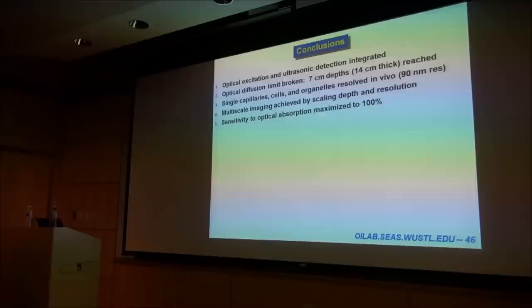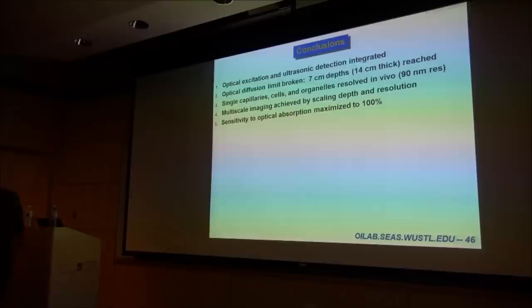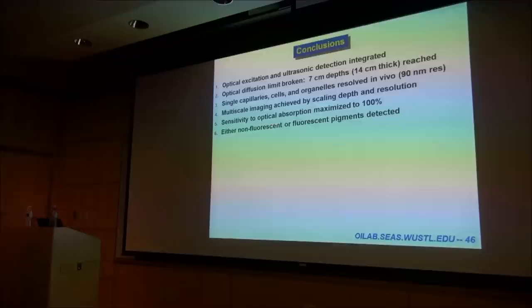The sensitivity to optical absorption is actually at 100%. Right, that's a very high sensitivity. On the other hand, we're not very sensitive to scattering. Right? If scattering is the contrast mechanism you're after, then you've got to pick something else.